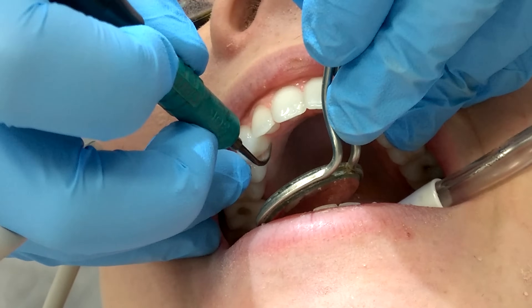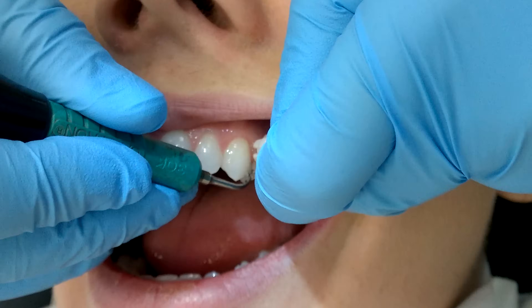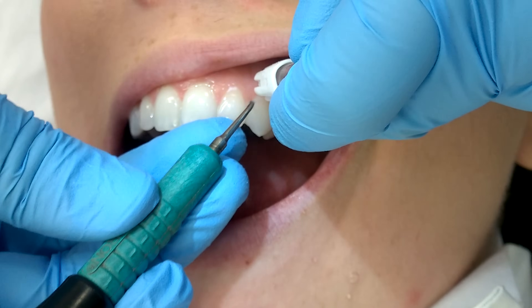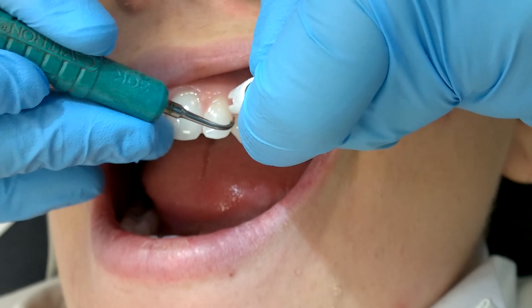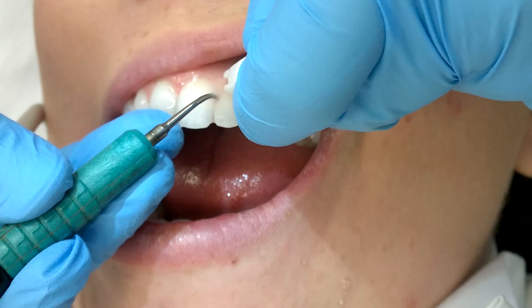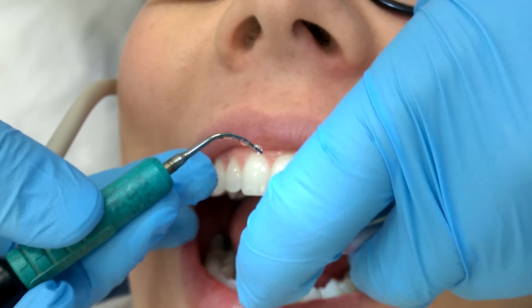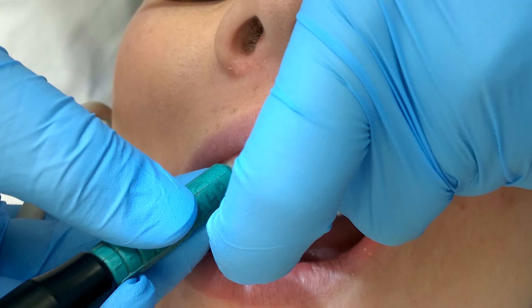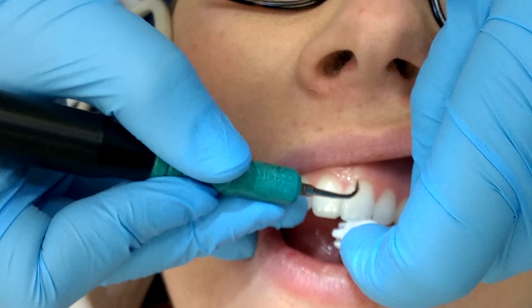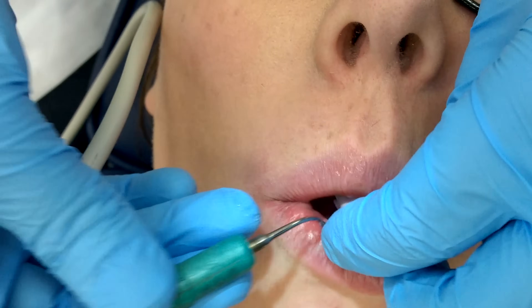One of my personal philosophies with the ultrasonic is that if it's not activated, you're not removing calculus and it's not doing its job. So feel free to keep the pedal to the metal, as I like to say, and do four or five teeth at a time before you stop and give the patient a break. As long as you keep the power at a level that's not too high and your water is flowing, your patient is going to be just fine.